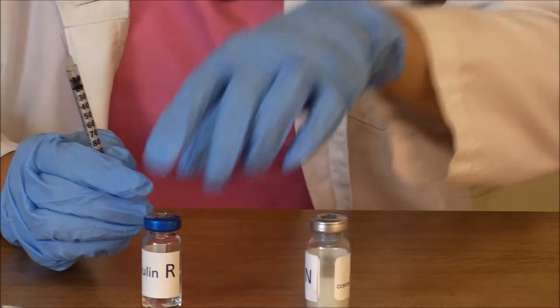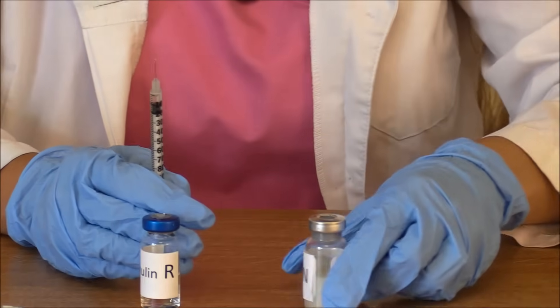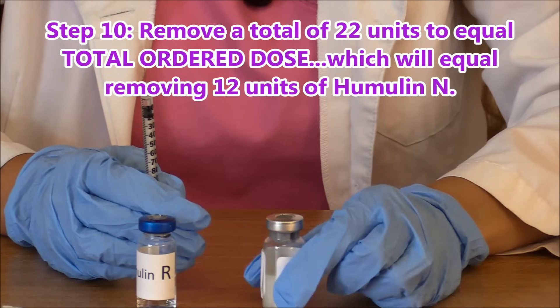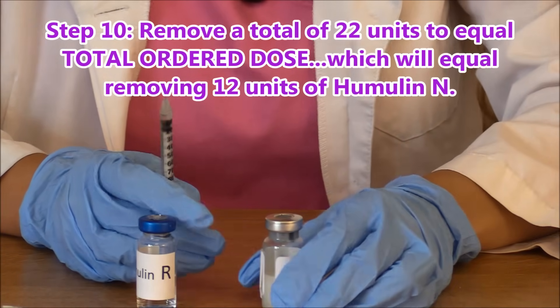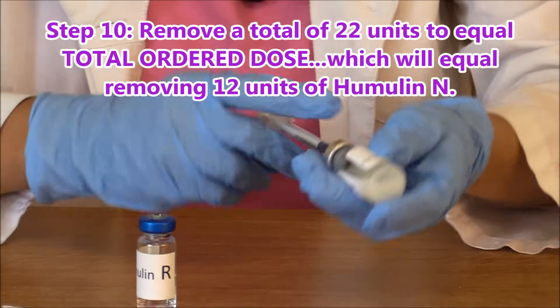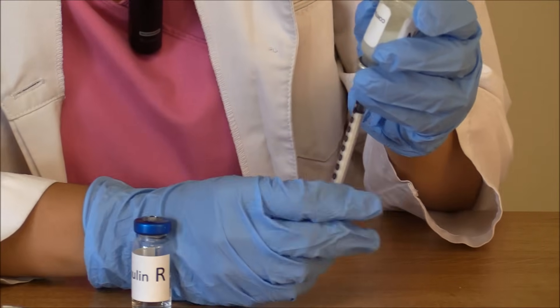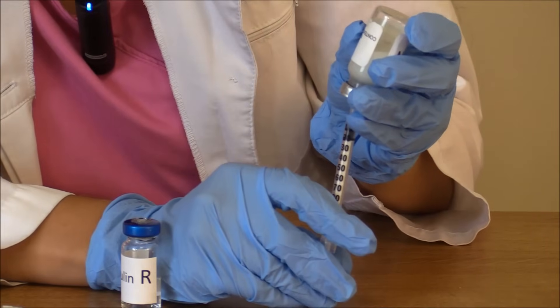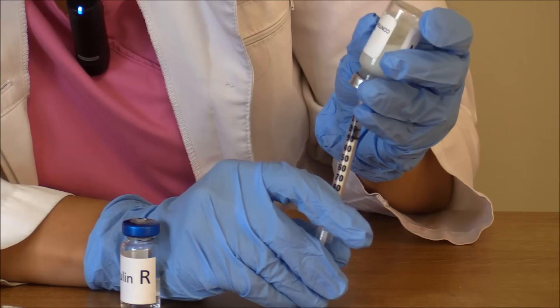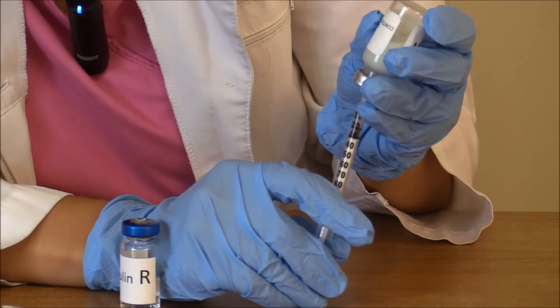Then we're going to go to our humulin N — that was the clear, now we're going to cloudy — and we're going to remove a total of 22 units for the whole total dose. Go into our NPH and remove a total of 22 units, and that will equal how much we're to give.